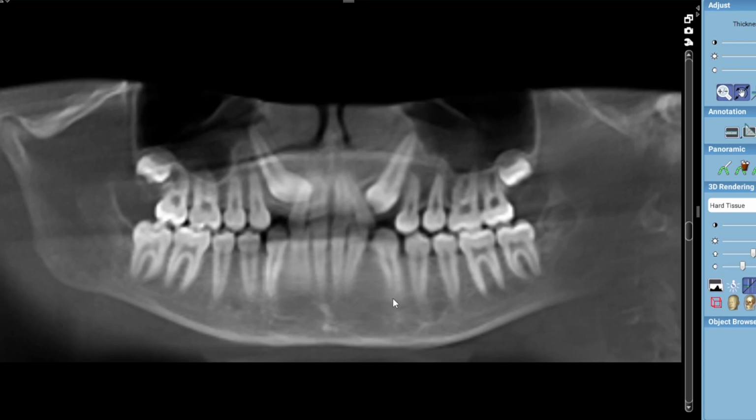Many dentists will get a screening x-ray even before they send you to see the orthodontist, and usually it looks something like this. This is called a panoramic x-ray, and what it shows us is all of your teeth at one time. You can see in this x-ray where this tooth looks like it's not quite in the right place. It's somewhere on top of this tooth. What we can't tell from this x-ray is where those teeth are in relation to each other. Which one is closer to the front, which one is farther behind. And we also can't see if there is any damage to either of those teeth, if they are even touching each other or if they're far away from each other.